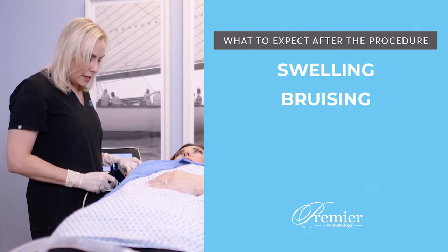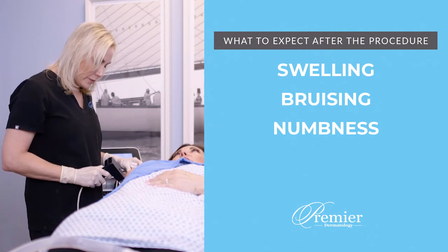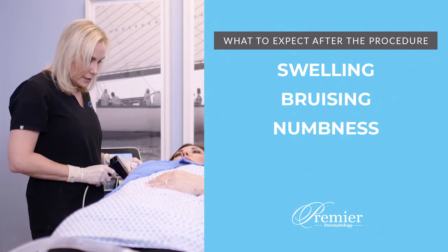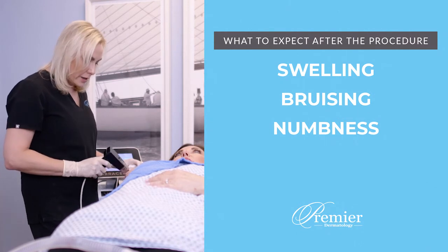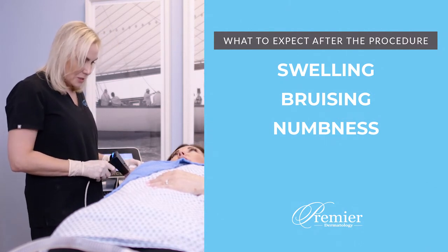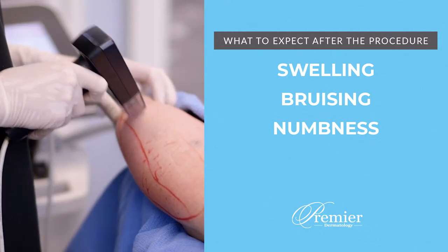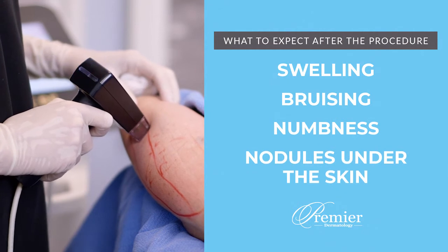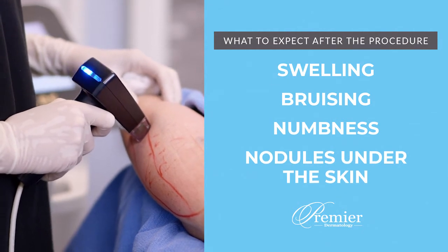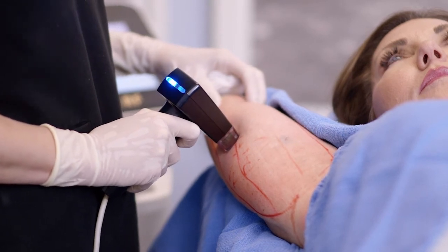And you may feel just a little bit of almost numbness in the area because the little nerve endings that are around the fat lobules and in the dermis that we're treating can kind of get irritated from the energy. And so it can make it feel kind of tingly or numb at times. Sometimes as the fat is getting broken down, you can actually even feel some nodules underneath the skin because this heats that fat and then the body breaks the fat down and takes it away.